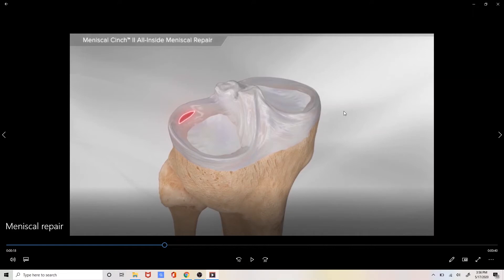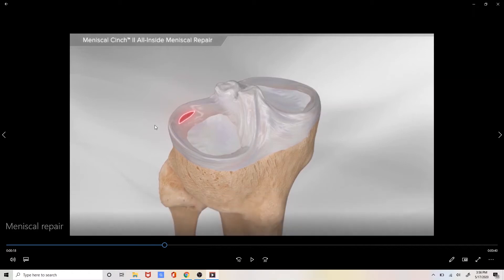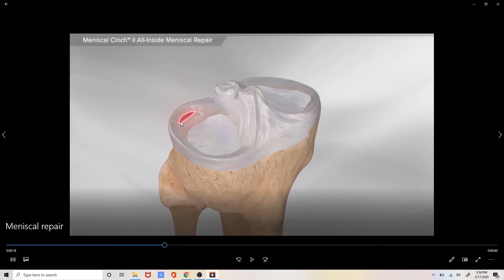In this particular surgical animation the patient has suffered a tear of their meniscus in the back portion of their lateral meniscus or the meniscus on the outside part of the leg. As we discussed previously in our meniscal repair video this tear is in a single plane.